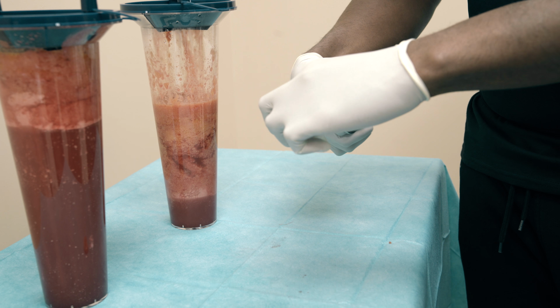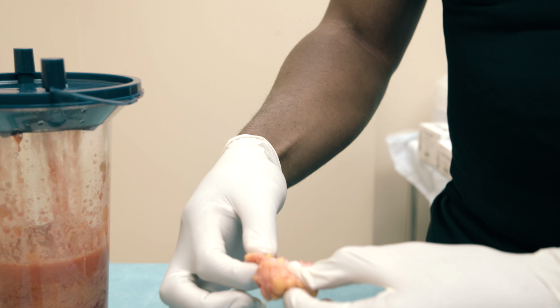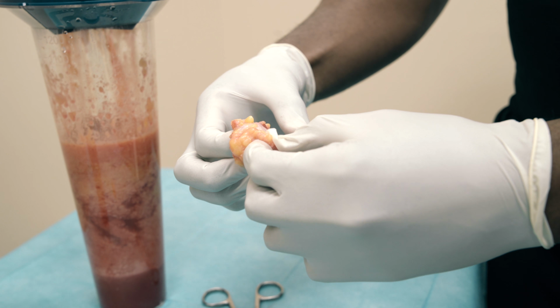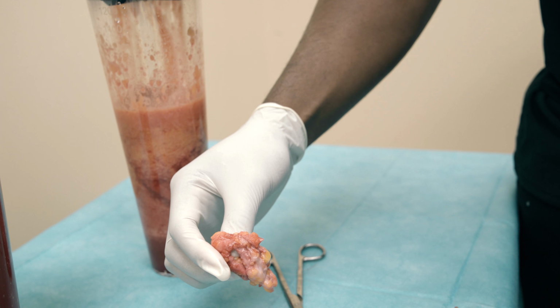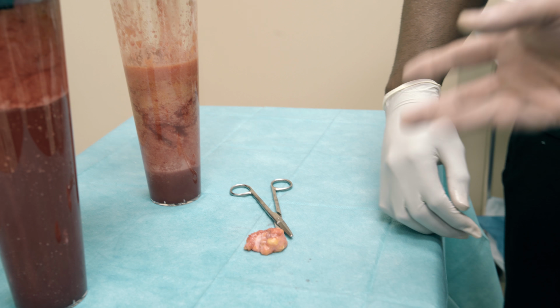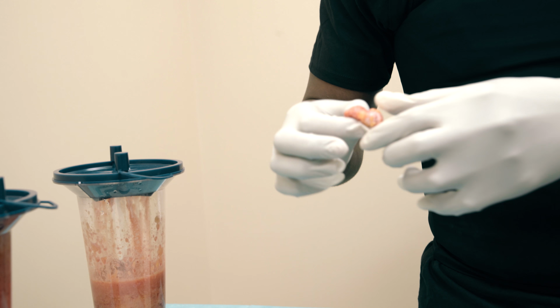Wow. We can now work this out, right? Yeah, and that's after it's been whittled down. Wow. Kind of fibro-fatty. So this is fat right here, the yellow. That's mostly fat just stuck underneath the gland. I even use a special basket cannula to really get it out. It got clogged. It just was clogging. So that you just have to cut out. That's the little one. That was on the right side.